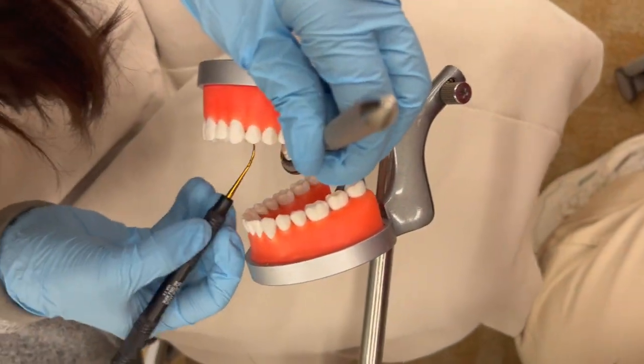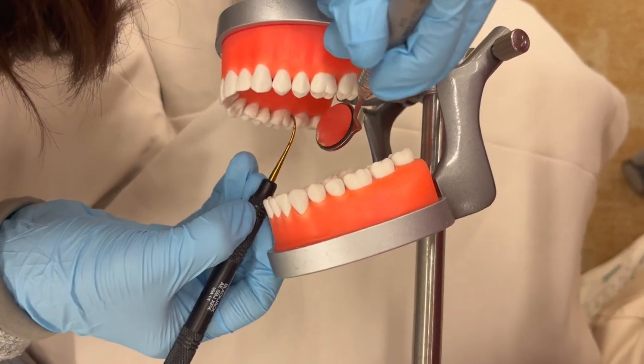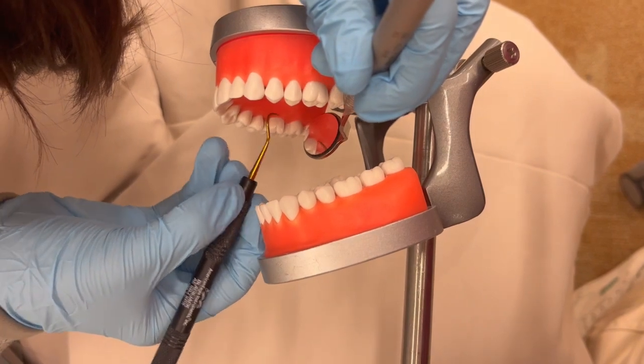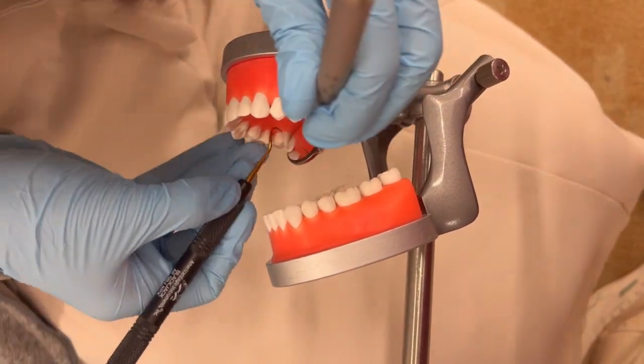So for the distal surfaces, you want to position the tip third of the working end at the distal facial line angle. Then you want to work back towards the distal surface and check your angulation. Make sure to tilt the lower shank towards the tooth surface, and the face should be at a 70 to 80 degree angle to the distal surface.